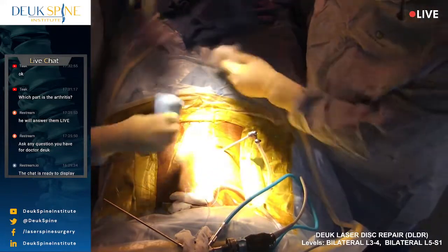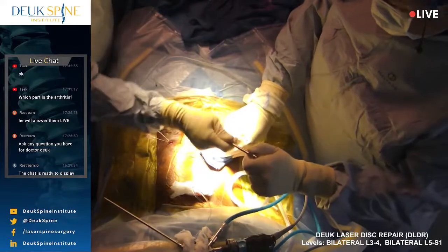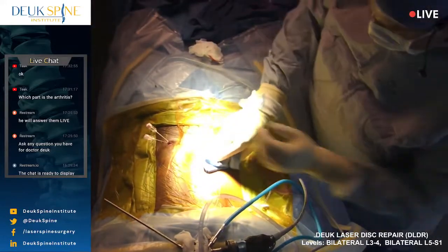Good job. We're almost done. We're done with half of the discs. We got the other half still to do. I'm going to come over to the other side.